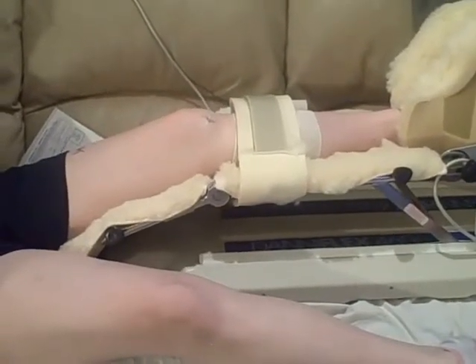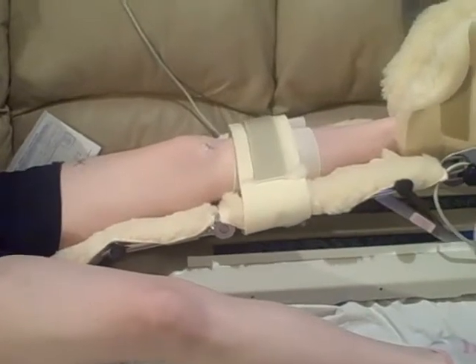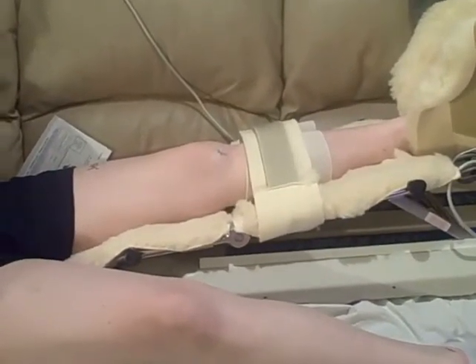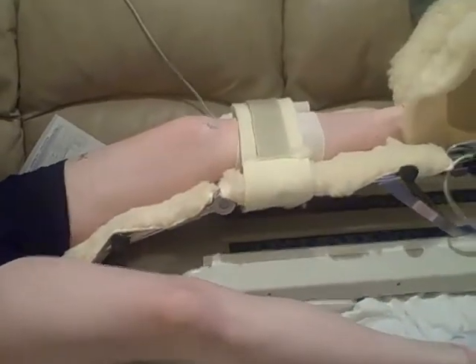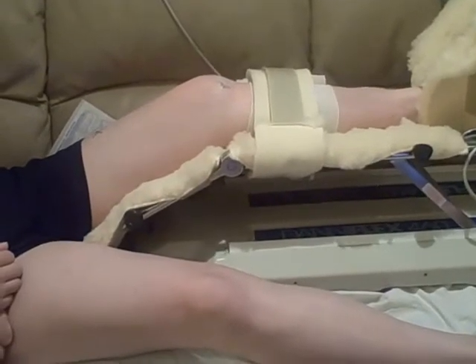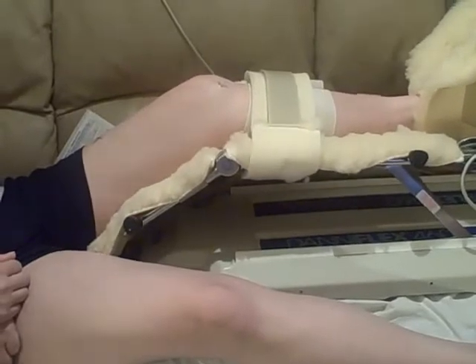One of the great tools that can help people after surgery to prevent scar tissue and hasten healing is the CPM machine, or continuous passive motion machine. Here is a patient three days post-op from knee surgery strapped into the knee CPM. The parameters are set — this one is set at zero degrees of extension and 35 degrees of flexion.